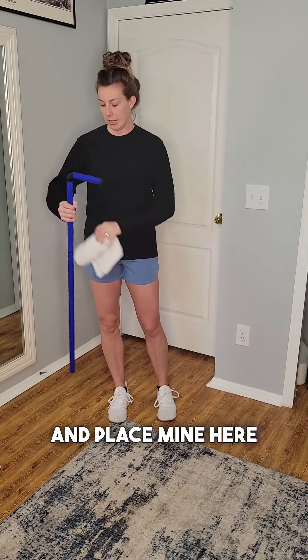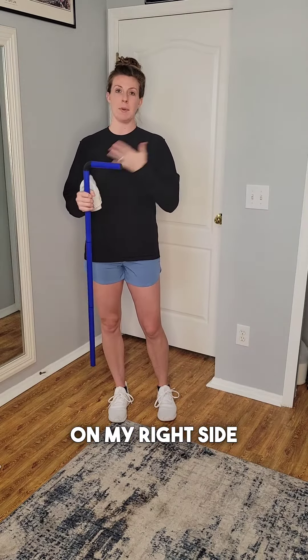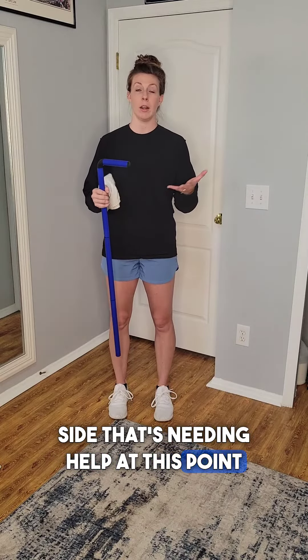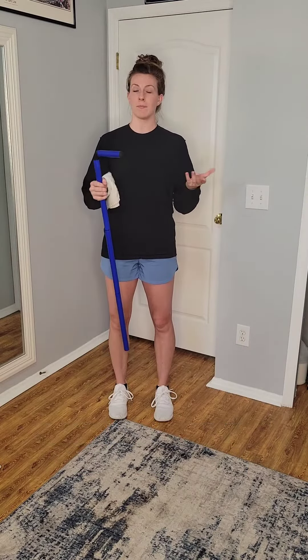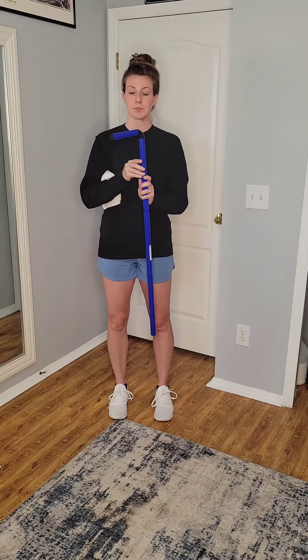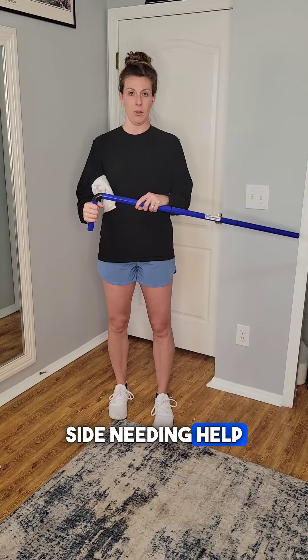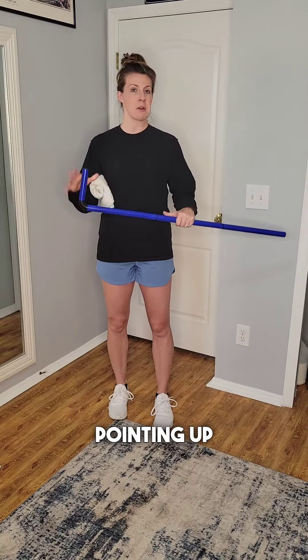I'm going to go ahead and place mine here. I'll demonstrate on my right side, but you're going to be practicing this on the side that's needing help, which may be one side or both. Your wand — the curved end is what we're going to hold with the side needing help. You can have the curved end pointing down or pointing up — it doesn't matter.